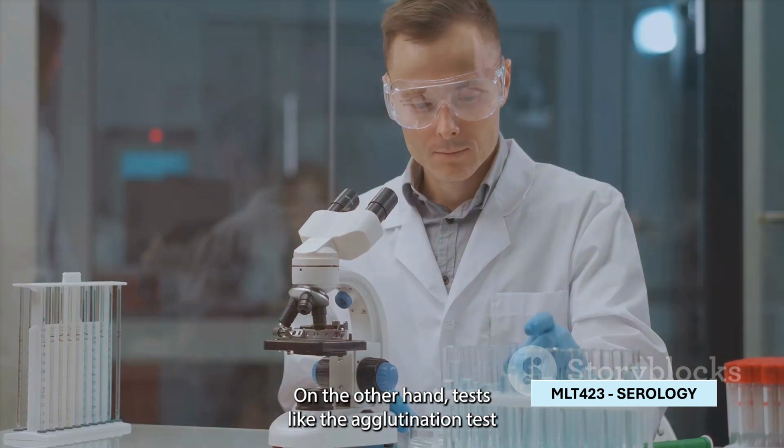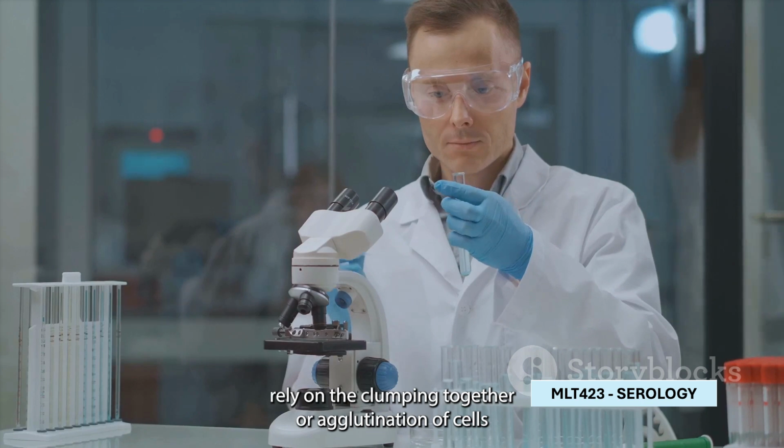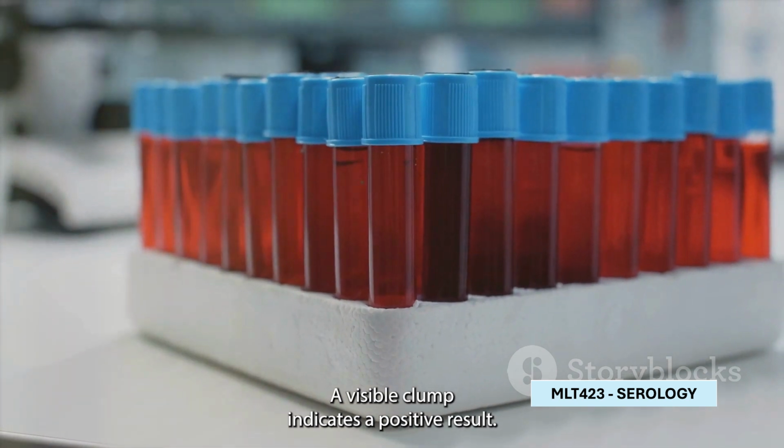On the other hand, tests like the agglutination test rely on the clumping together, or agglutination, of cells or particles in the presence of specific antibodies. A visible clump indicates a positive result.